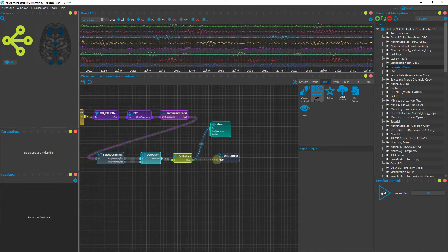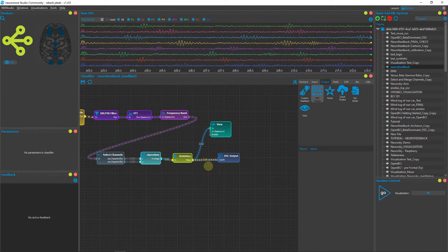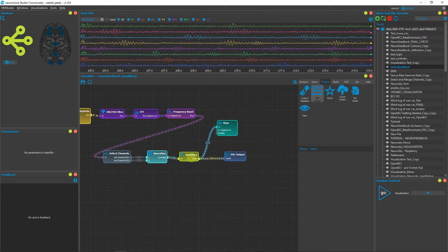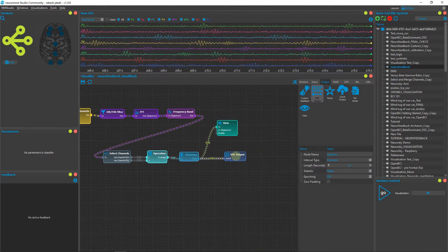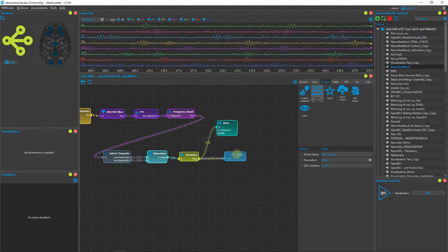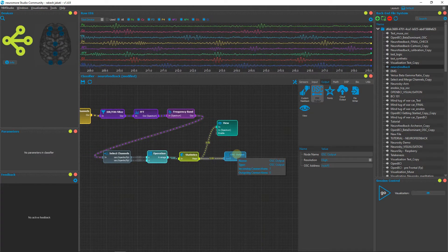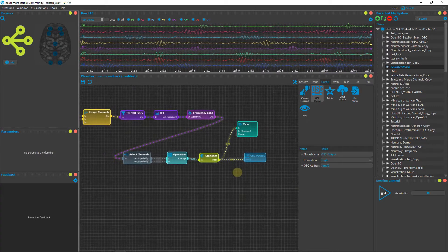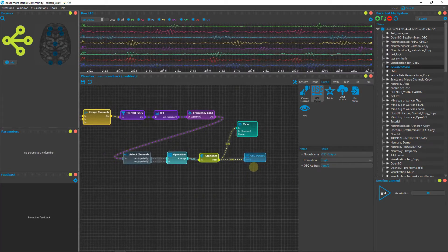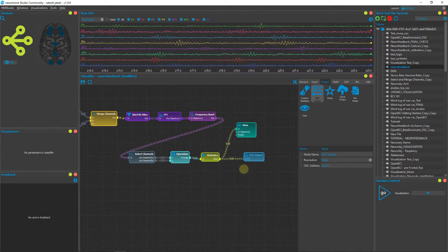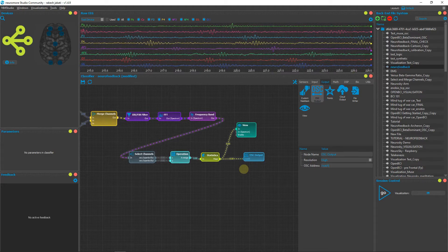Select the OSC Output node and drag it to the pipeline, then connect the Statistics node to the OSC output. Whatever neurofeedback value we get, we can send it to an address — either a Raspberry Pi or local computer. We can then use this to find our neurofeedback threshold value.